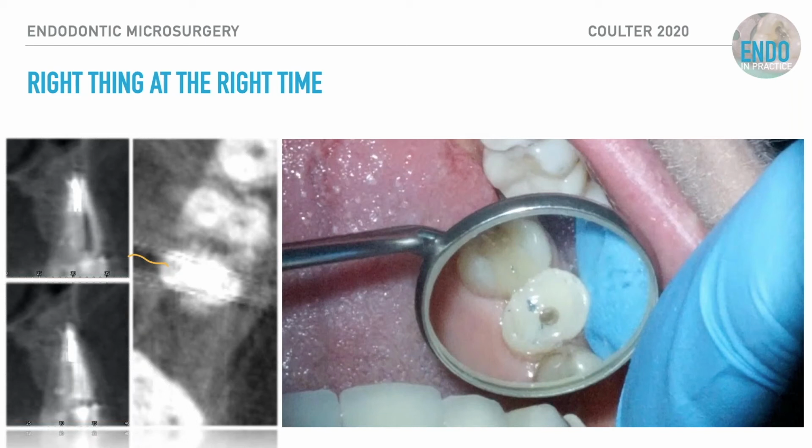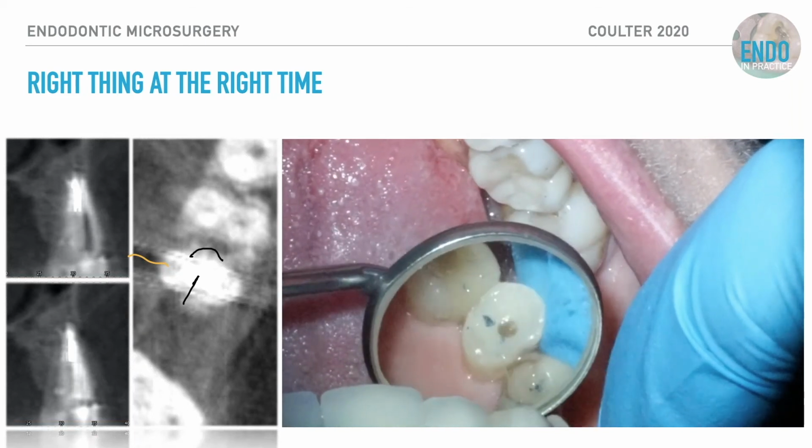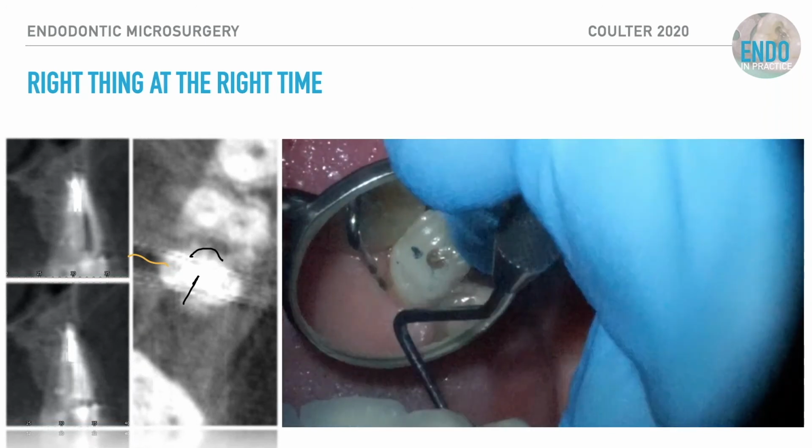And while you may not be able to see an absolute fracture, what you would look for would be bone loss adjacent to a fracture. But again, you're not going to see that. All I can really tell is if you look in the top left, that again, there is no obvious periapical radiolucency. So when I'm looking at this tooth that's been endodontically treated twice, it's now heavily restored with a post. It's been to 3 different people for 3 different opinions about pain. When I go and examine the patient, I cannot precipitate the discomfort.